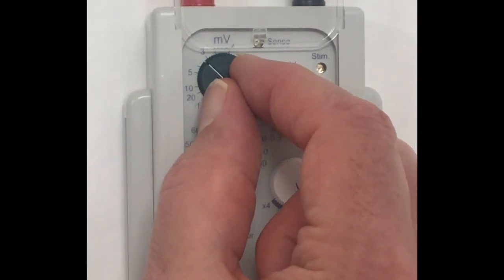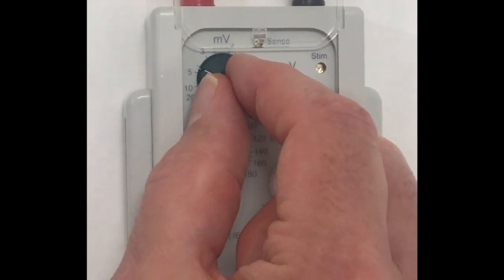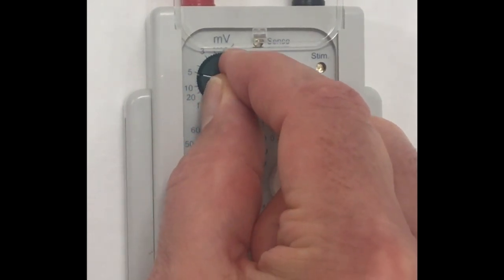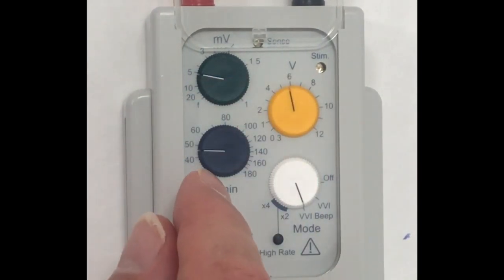I gradually increase it until I am not sensing anymore and I start to see pacing spikes denoted by this light turning yellow.